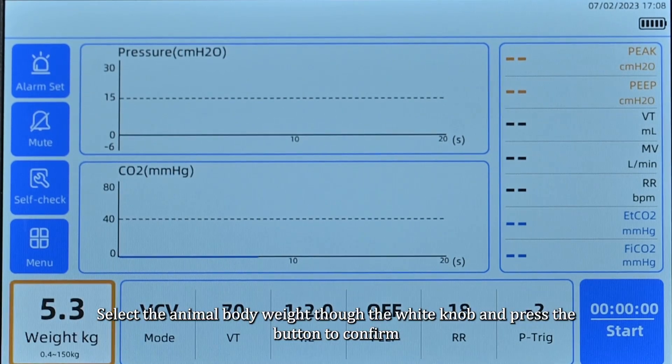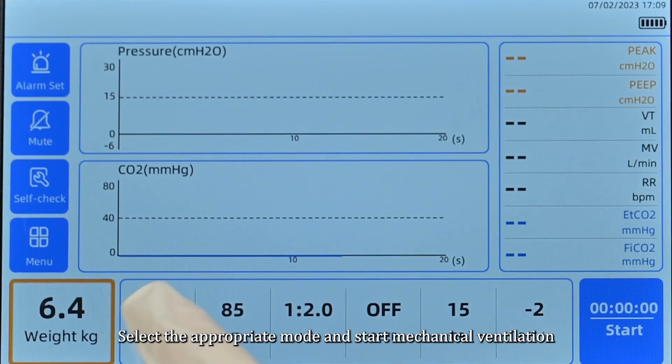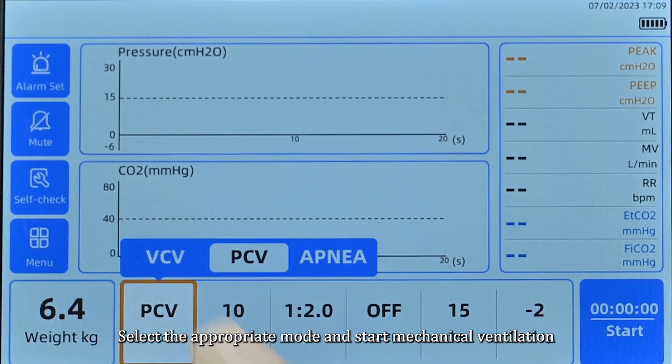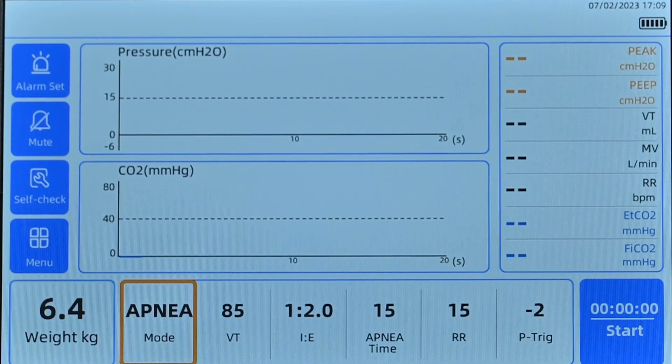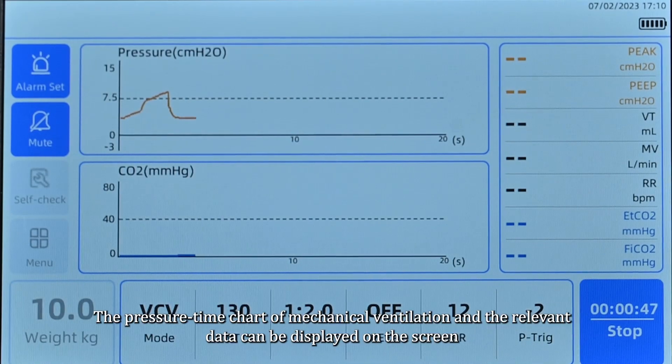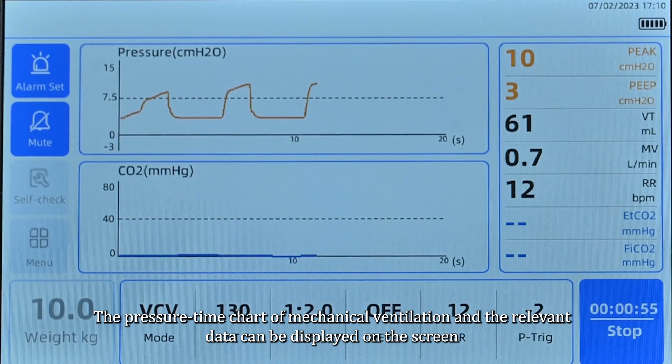Select the animal body weight using the white knob and press the button to confirm. Select the appropriate mode and start mechanical ventilation. The pressure-time chart of mechanical ventilation and the relevant data can be displayed on the screen.